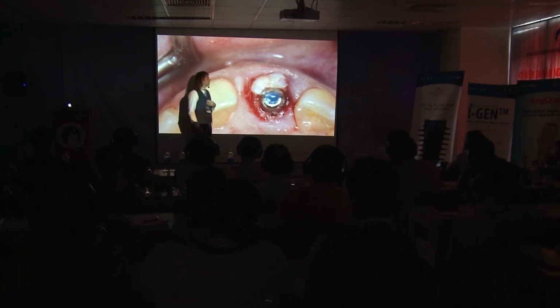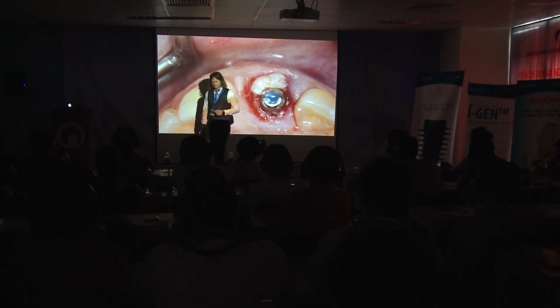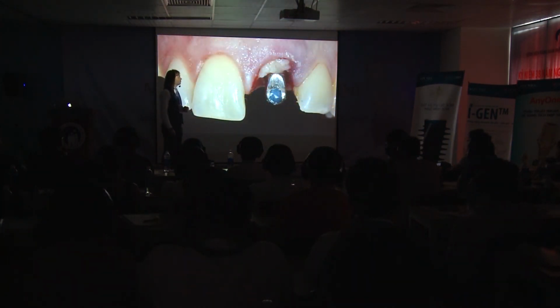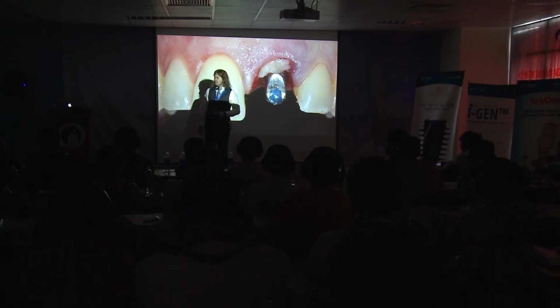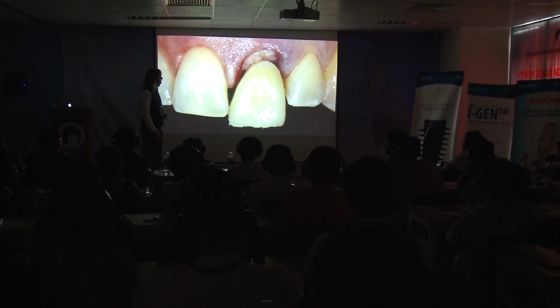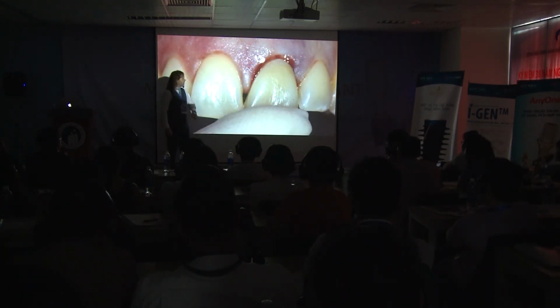But my problem is that because I placed too much bone under, the graft was too much on the surface. You see, the graft is not inside. My bone is not inside. So I use the provisional to push it up. And up to now, everything seems very good.